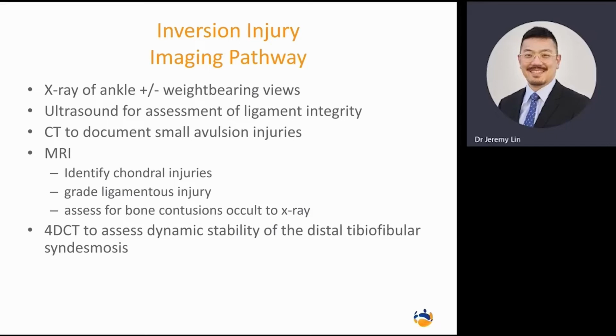That allows us to say definitively whether or not the patient has a high ankle sprain, if that is one of the things that people are concerned about. It also gives us the opportunity to grade how bad the injury is, because a sprained ATFL versus a ruptured ATFL will have different management outcomes. You would rest for much longer and potentially consider strapping and icing for much longer, and they may need physiotherapy later on to strengthen the supporting ligaments and tendons once the acute episode has passed to prevent further injuries down the line.